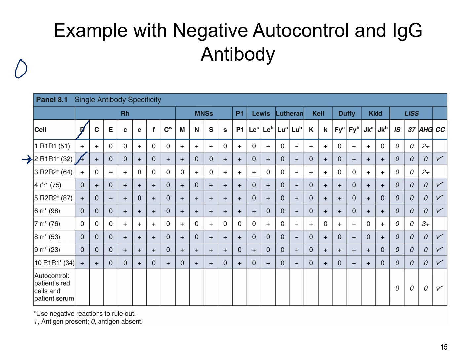So our next is a big C, but we also know that big C is inherited with little c. So we're looking to see, is big C heterozygous or homozygous? Well, it is homozygous big C, which means that we can go ahead and safely rule that out. Next, we look at E. So big E and little e are inherited together. No big E present.